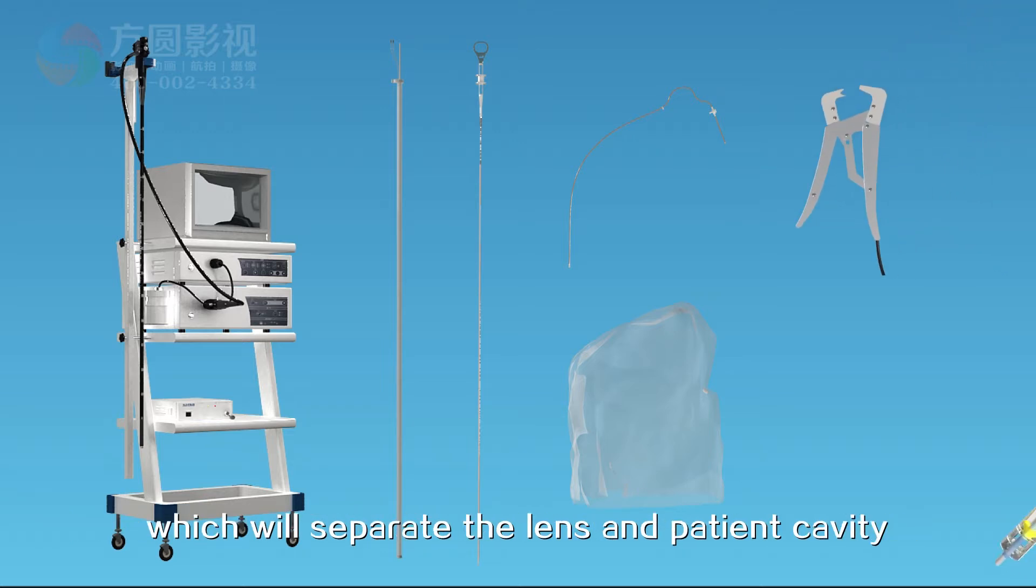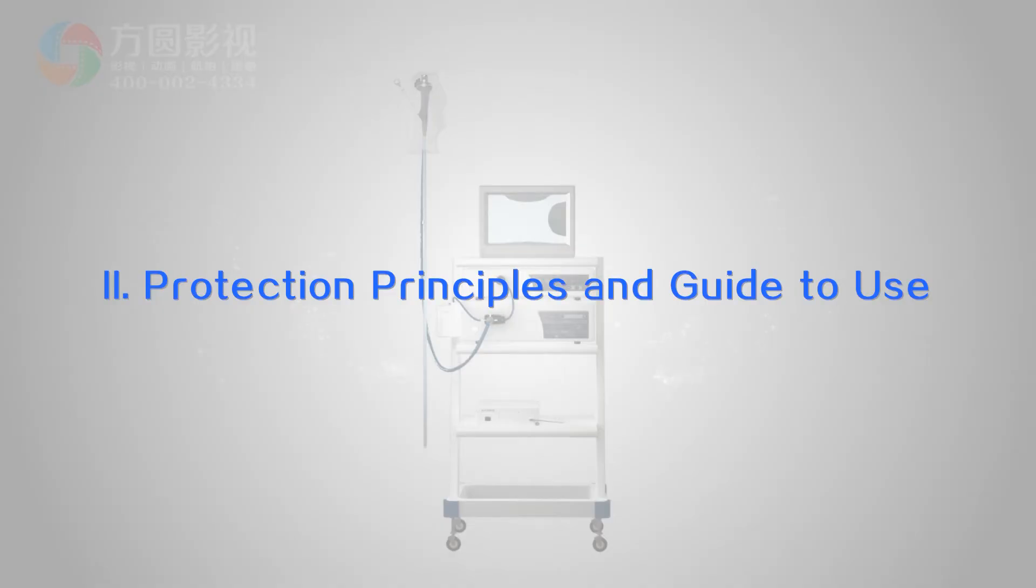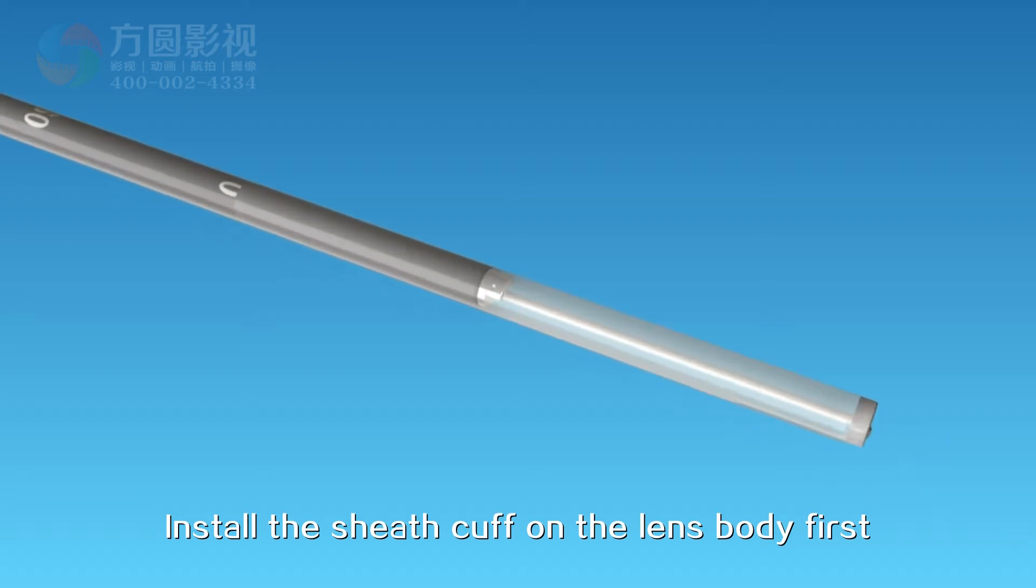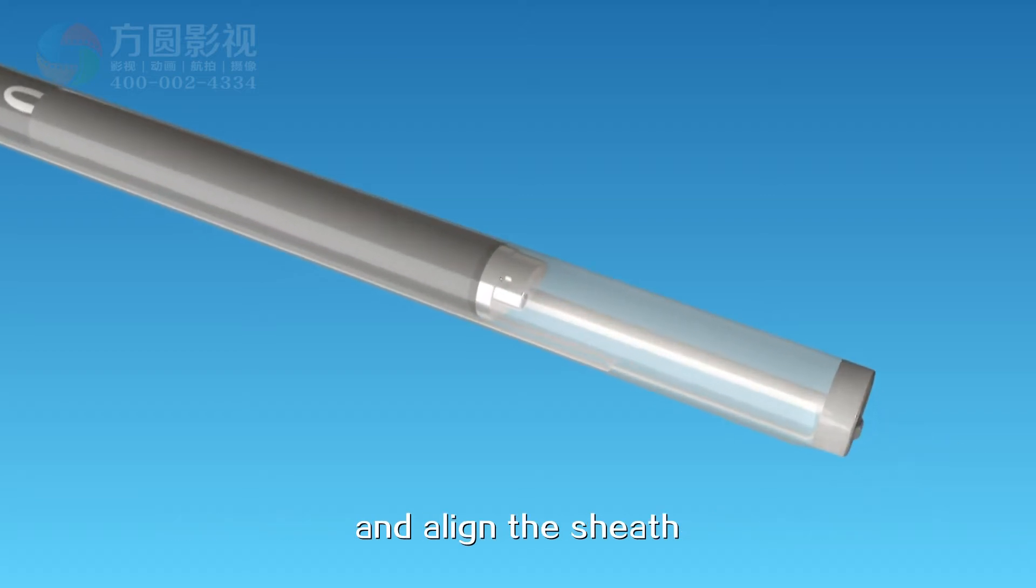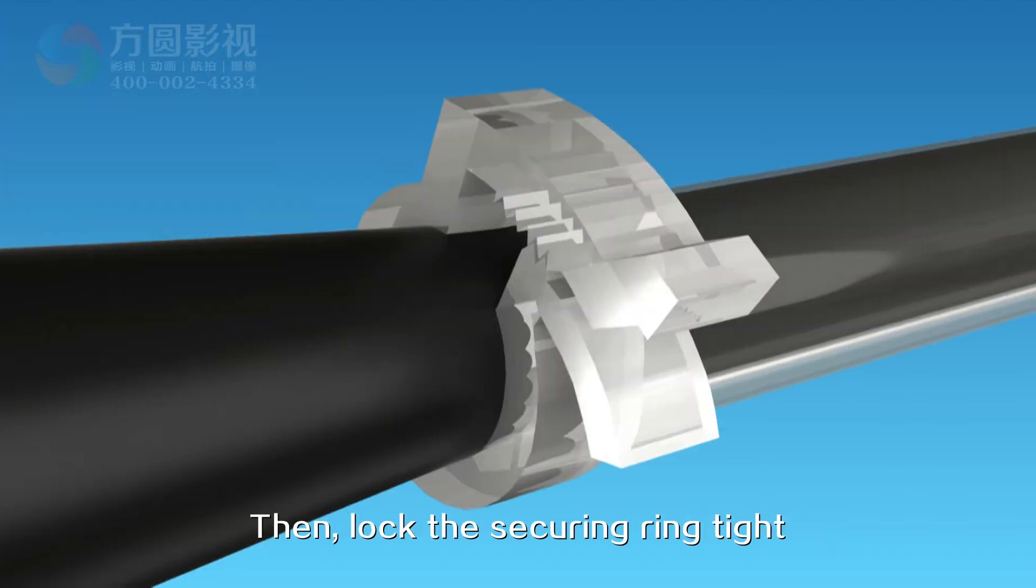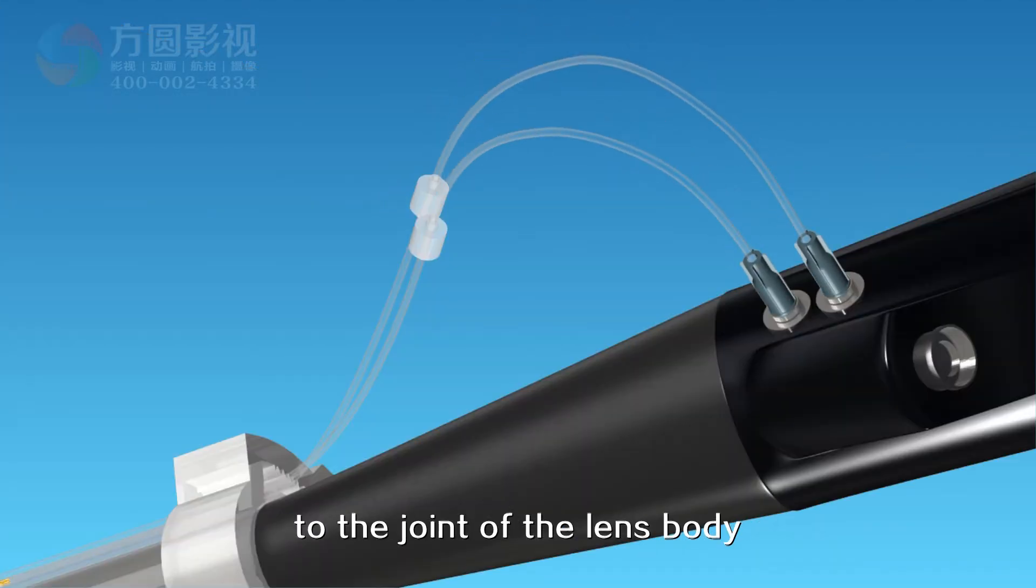The device will separate the lens and patient cavity and be discarded after use. The product has the same effect as disposable endoscopy. Install the sheath cuff on the lens body first and align the sheath end and lens head of the endoscopy, then lock the securing ring tight. Connect the water air tube head to the joint of the lens body.